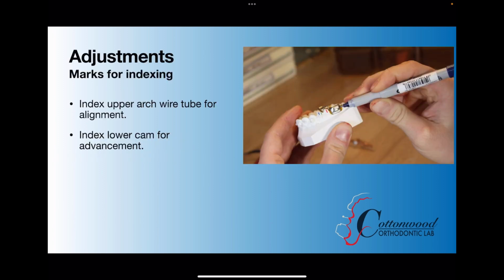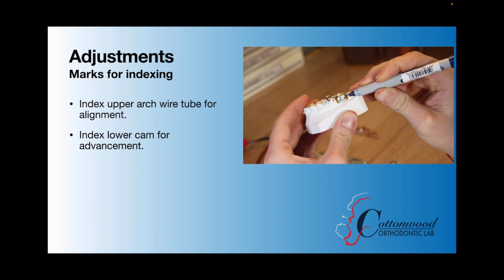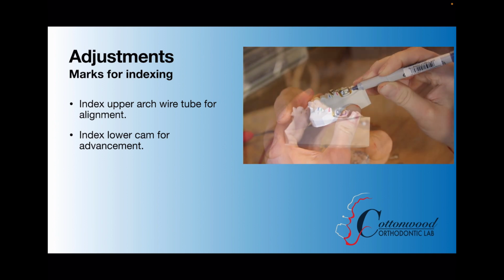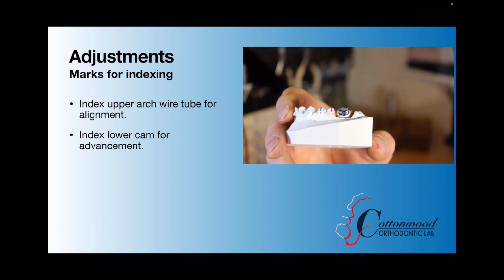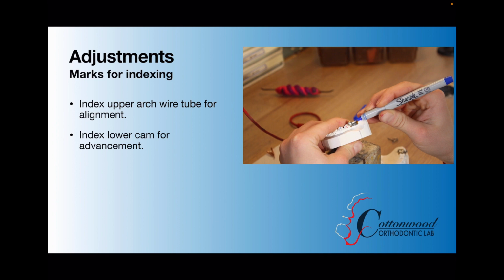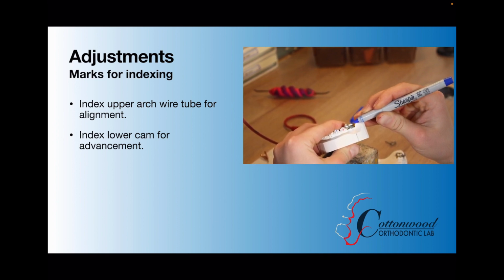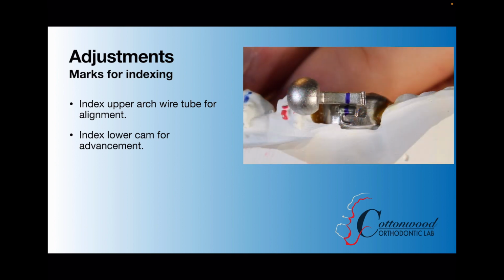Before you get into adjustments, it's a smart idea to index all of your archwire tubes around your bands. That way you know where you're moving things and where you're going. As you can see here, we just go right around that archwire tube and mark it using a Sharpie. Then we do the same thing on the lower. Make sure you index that cam where it is for your anterior-posterior relationship. That's how you can adjust your midlines and advancement.